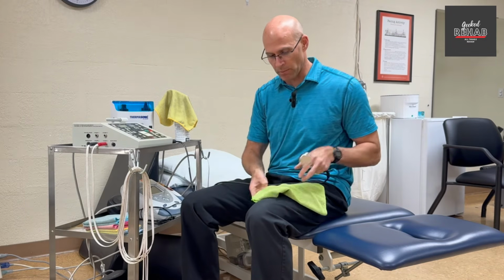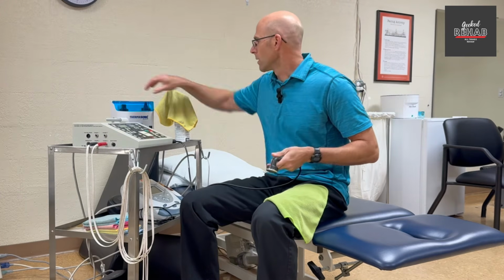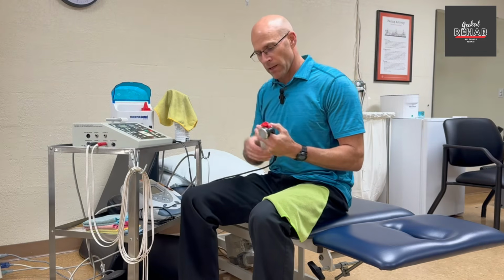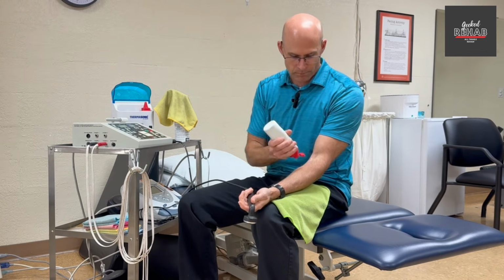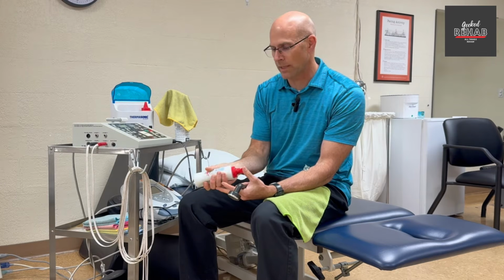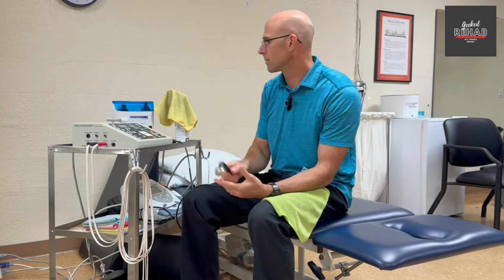So I'm going to give you an example. I'm just going to turn it on here and let you see that it's not scary. It doesn't cause any muscle spasms or anything like that, but it can create a deep ache.